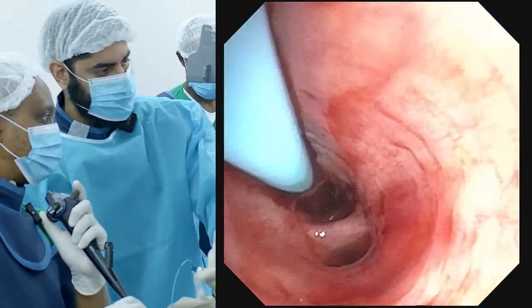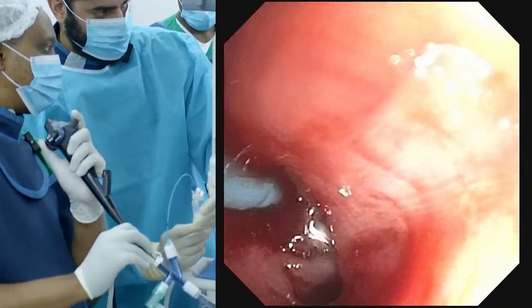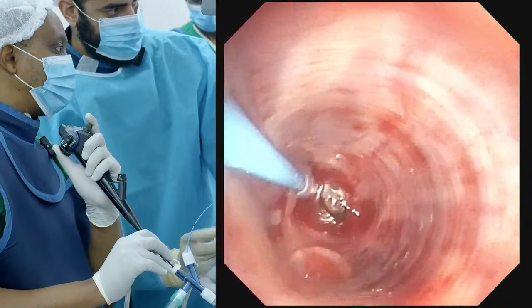Just press the balloon. Yeah. I'm gonna pull it out a bit. Good. I think you can get a biopsy. Yeah, yeah. I'll keep the balloon here.